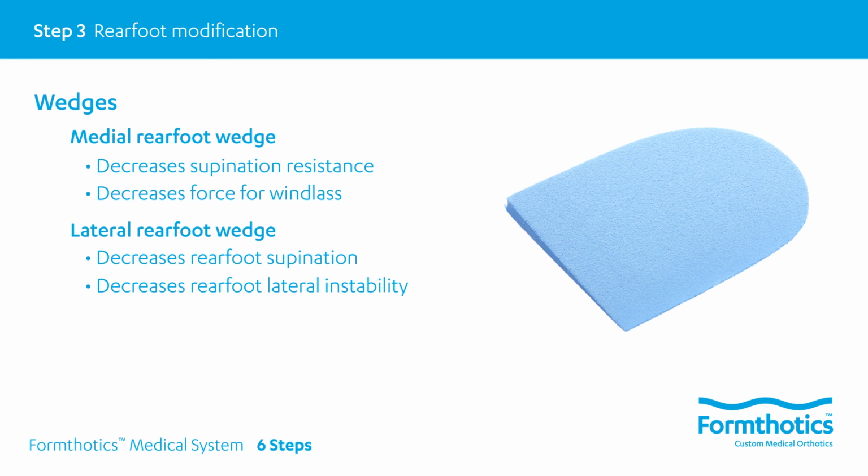Consider whether or not the patient has the joint range of motion available to be able to manage the force that is applied by the modification. Also, consider how the modification may affect other musculoskeletal systems within the kinetic chain.